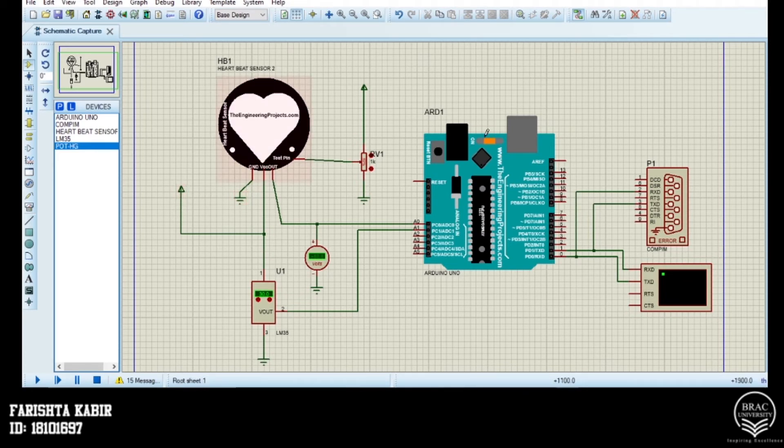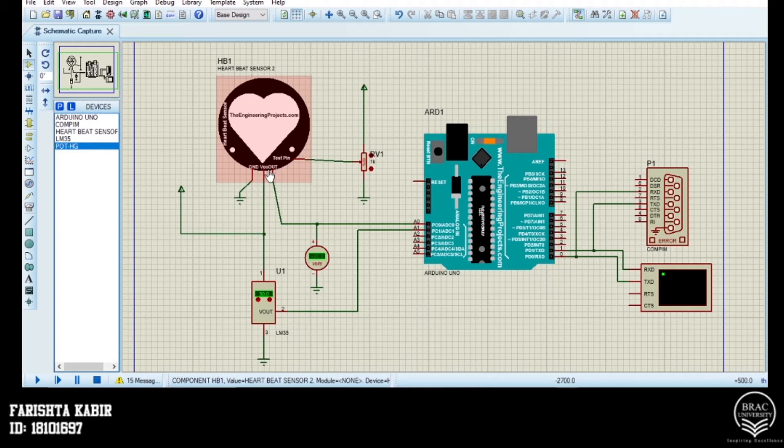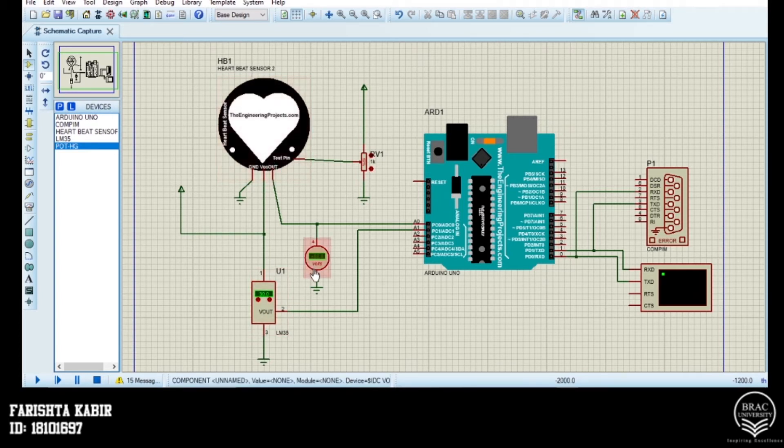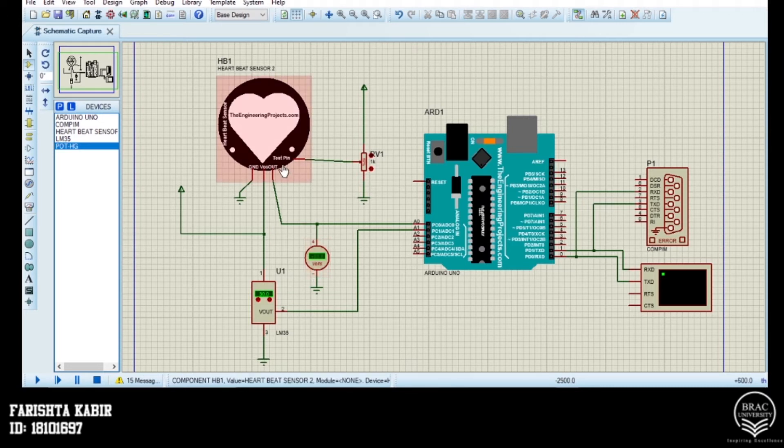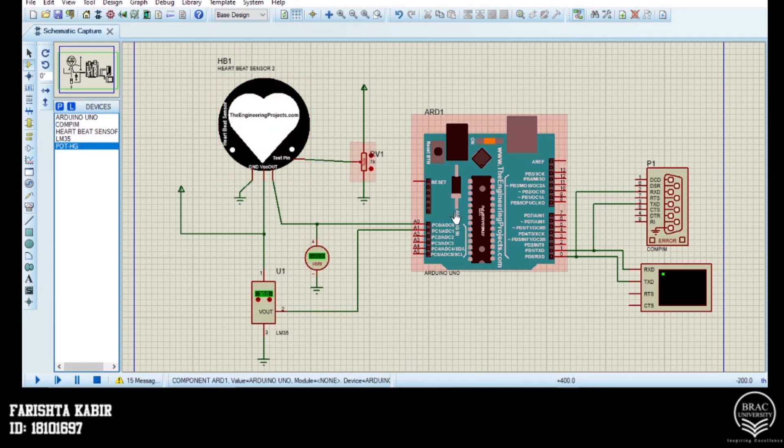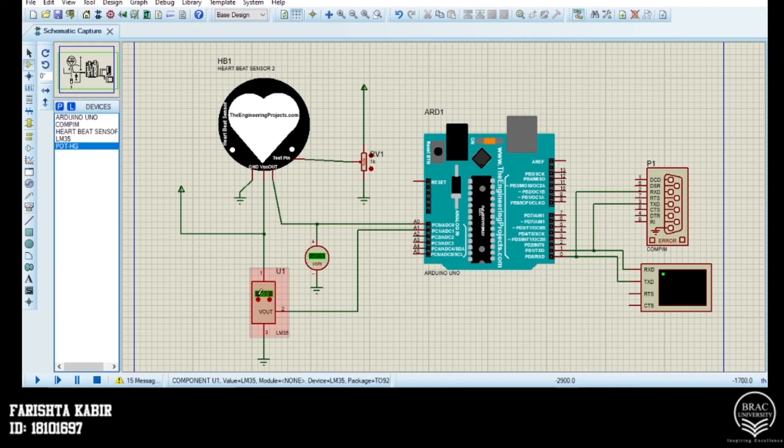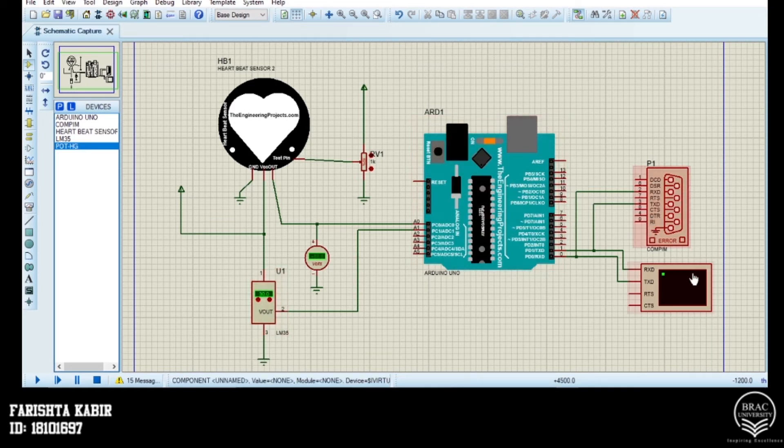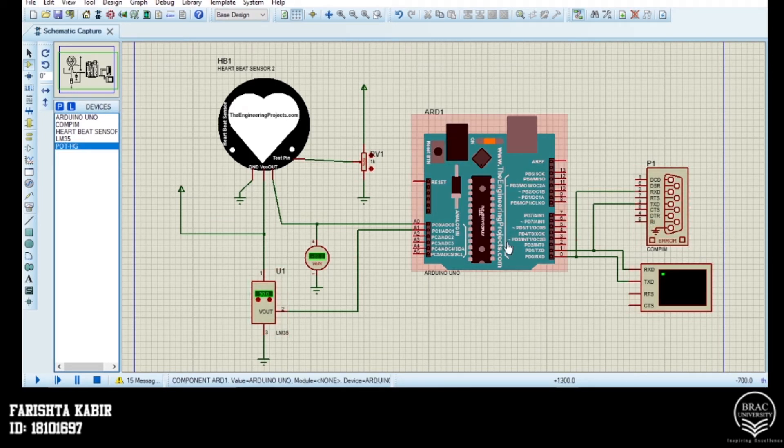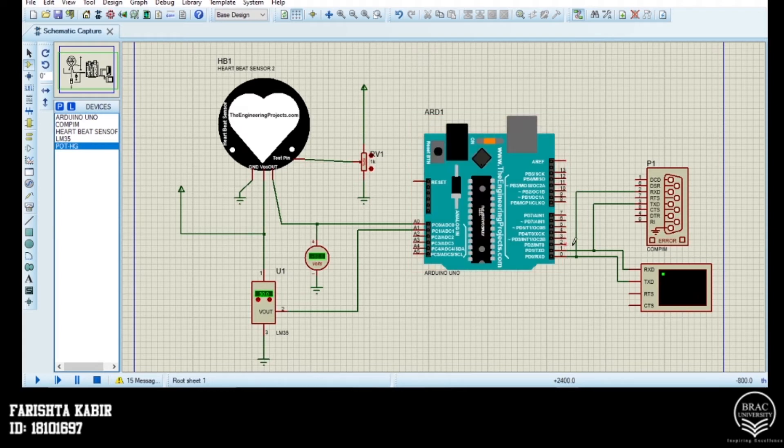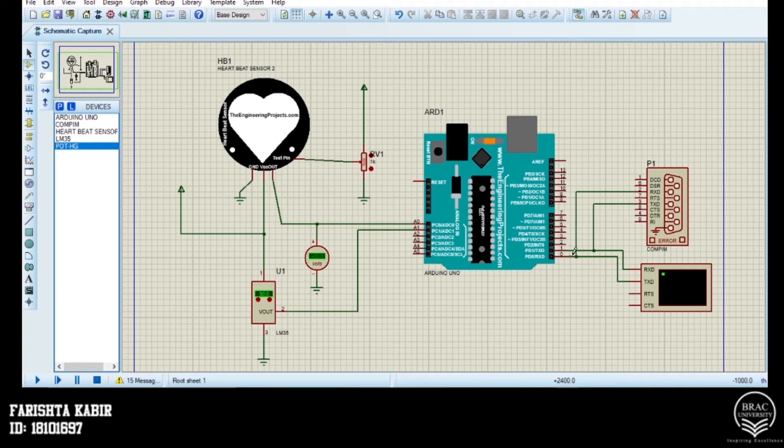For the pin configuration part, we have connected the VCC pin of the heartbeat sensor with our LM35. The Vout pin with the voltmeter. The test pin with our potentiometer. The Arduino's A0 and A1 pin is connected with the voltmeter and LM35 respectively. The COM port and the virtual terminal is connected with the Arduino according to their RXT or receipt data and TXT or transmit data pins respectively.